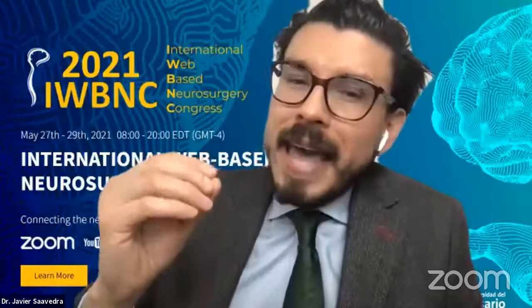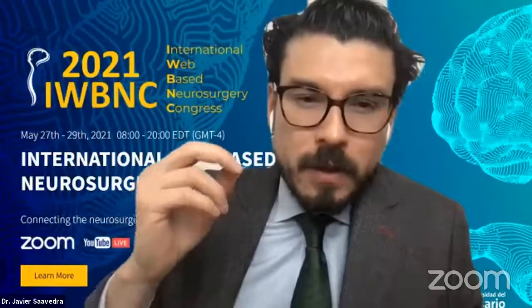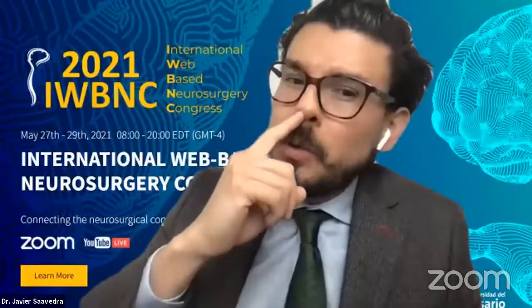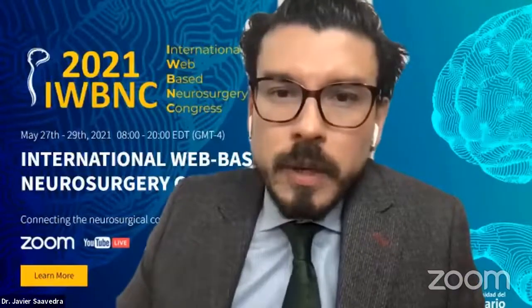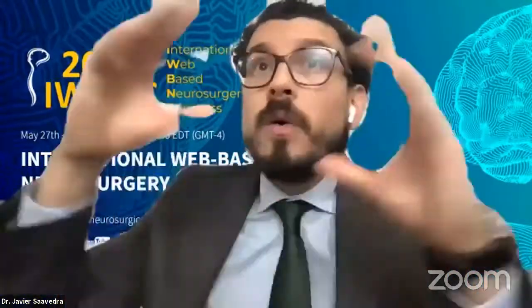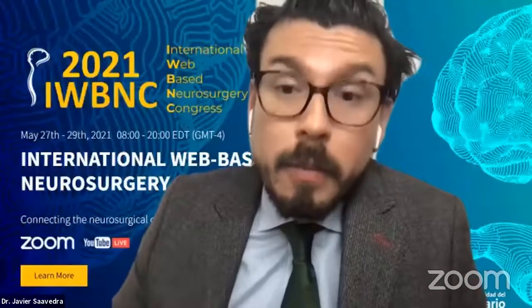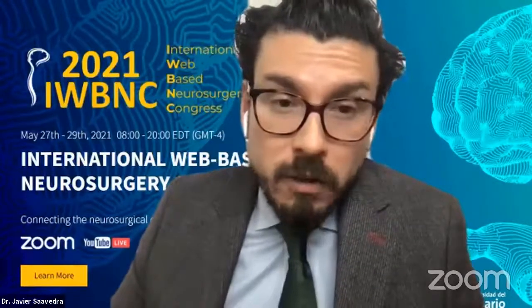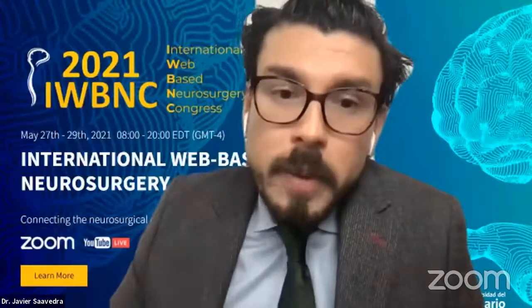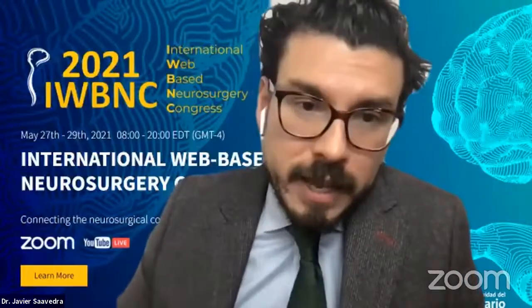So, for example, handling the scope could be tricky, because in the nose you have the nostril that helps you to retain the scope there, but in the orbit you don't have that. So it's sometimes tricky, but you get used to it, and you have a wider angle of vision than in an open approach. I mean, most of these lesions, for example, trigeminal schwannoma, you will have to do a very extensive open approach, it's a morbid approach, and your angle of vision is not that good. And through the TONES, it's a perfect procedure for that kind of lesions.